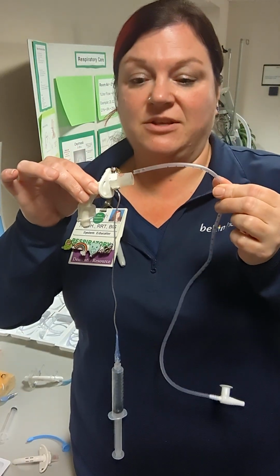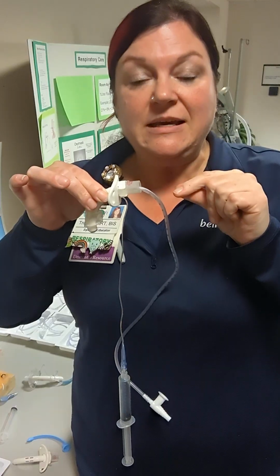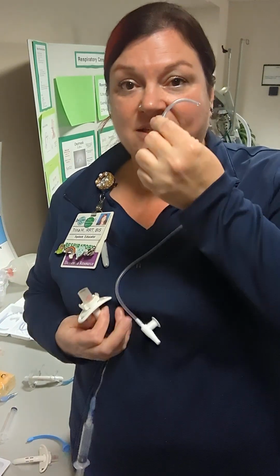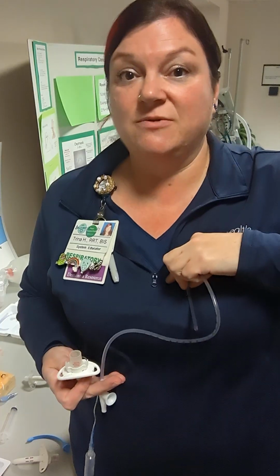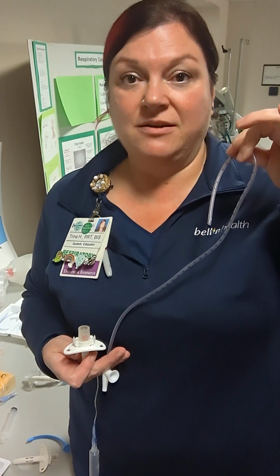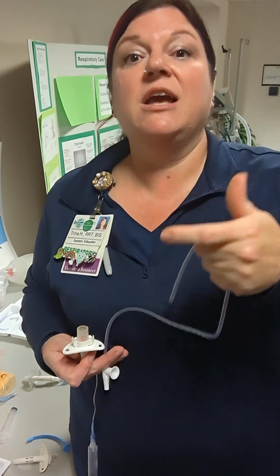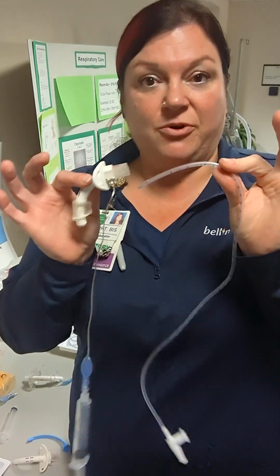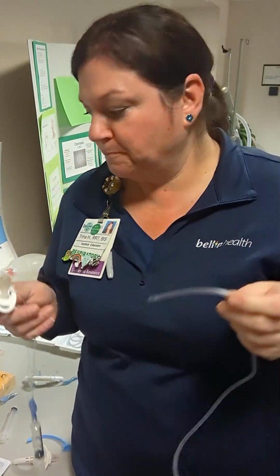You cannot leave this suction catheter in, because that's the only air they're using. If I was NT suctioning and I hit that sweet spot, I can suction, suction, suction, leave my catheter in, let the patient recover, suction, suction, suction, and then remove my catheter. But for a trach, it needs to come out in between attempts.